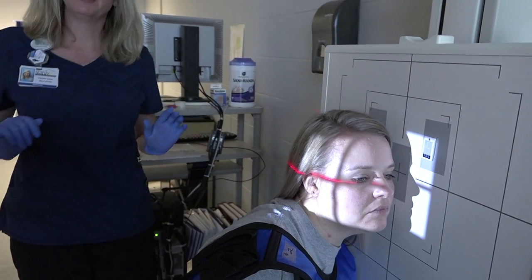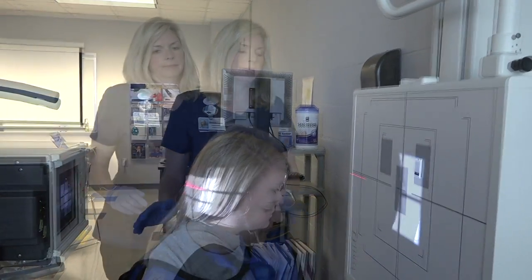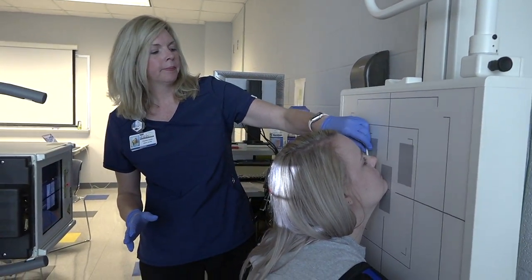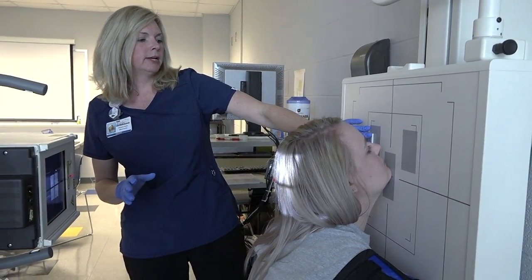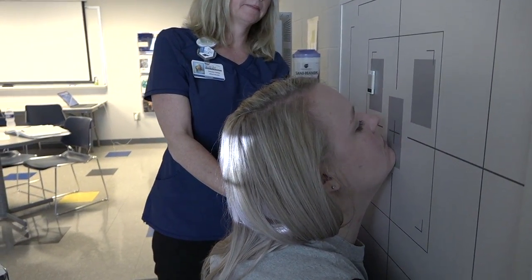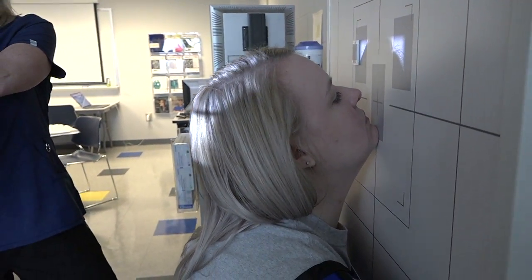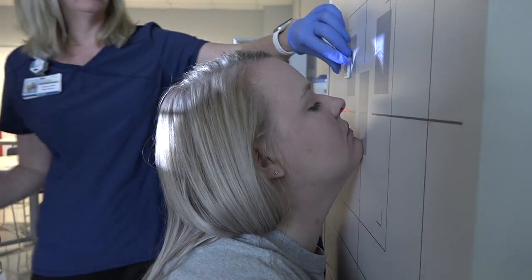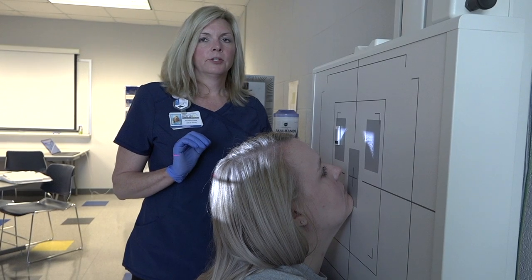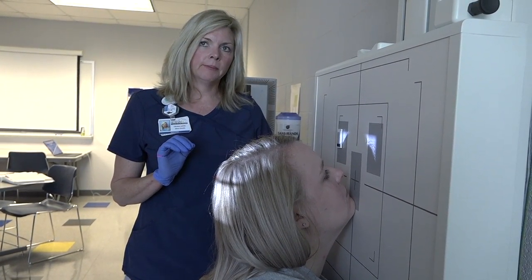Our next projection will be the Waters, and this Waters is the same for the skull and the sinuses — this is where we're kind of lifting our chin up above water. Our centering is to the acanthion, so we'll move the bucky up right under the nose and lift our tube to line up. Our central ray goes to the acanthion, and the OML forms a 37-degree angle with the image receptor.